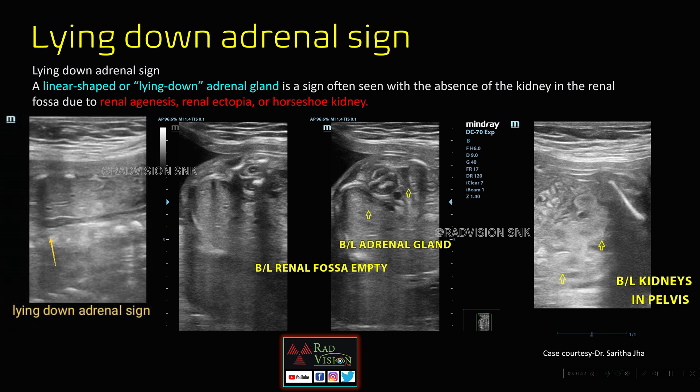In this case, you can see these are the bilateral pelvic kidneys. Remember the lying down adrenal sign as a sign for renal anomalies — definitely check for empty renal fossae and also look for ectopic location of the kidneys. Thanks to Dr. Sarita for contributing this case.